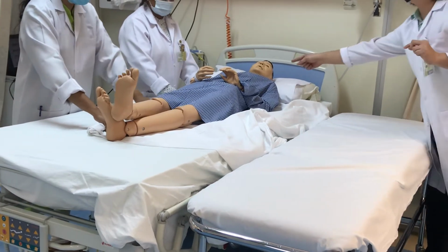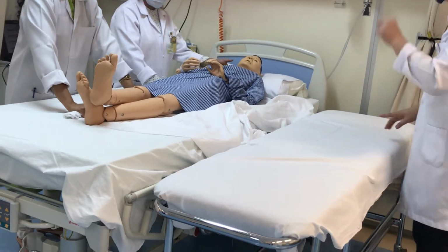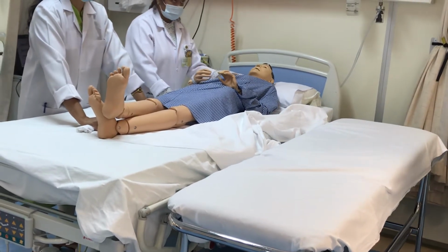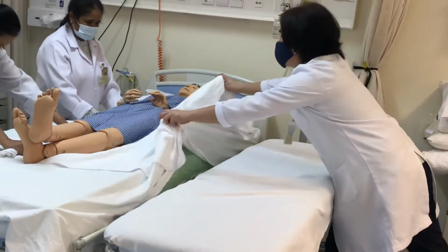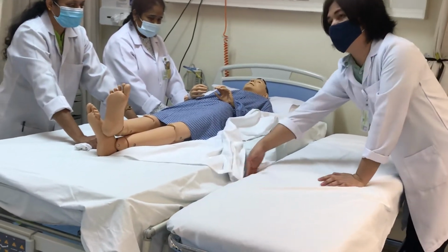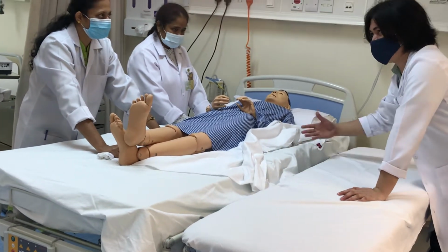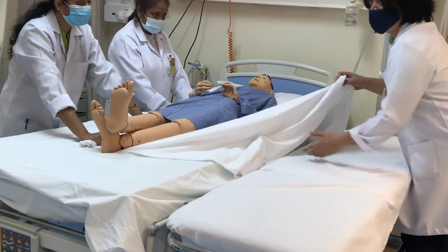Again, if there is a surgical involvement, you need to ask for another nurse. This is the heaviest part. Reach the turn sheet. Now, in the book it says if you have additional linen, you can actually fill in this one. But if not, you can move with the use of turn sheet.